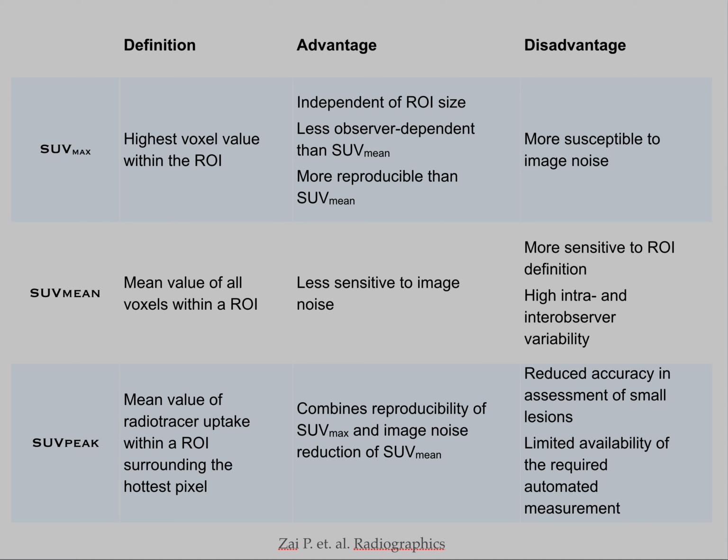In theory, they should have significant advantages over SUV max, but the software is not that widely available, so most places still continue to use SUV max. And if you look at the publications in the modern literature, again, virtually everyone continues to use SUV max.